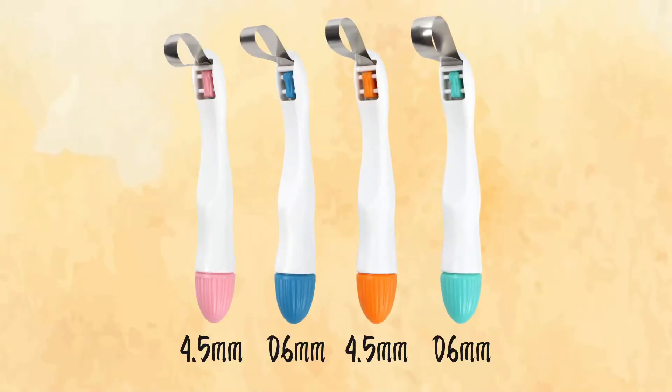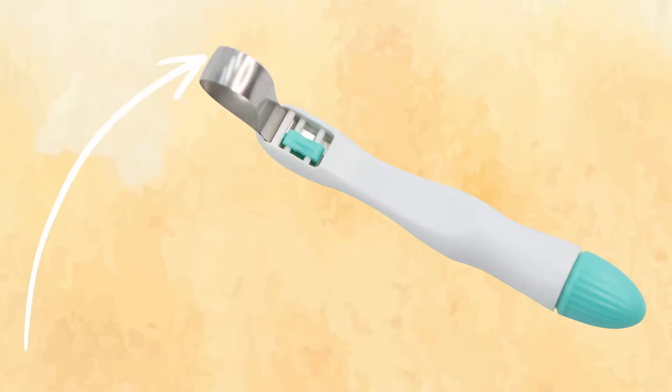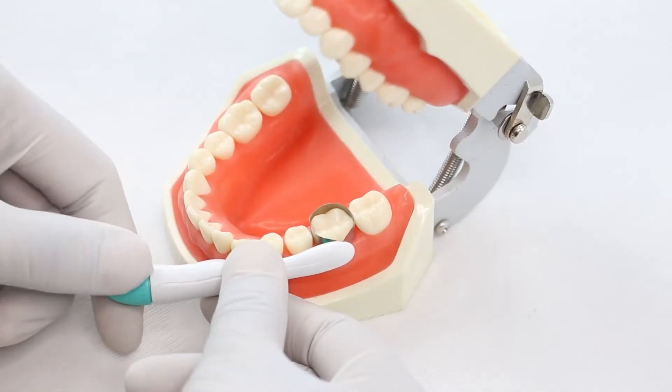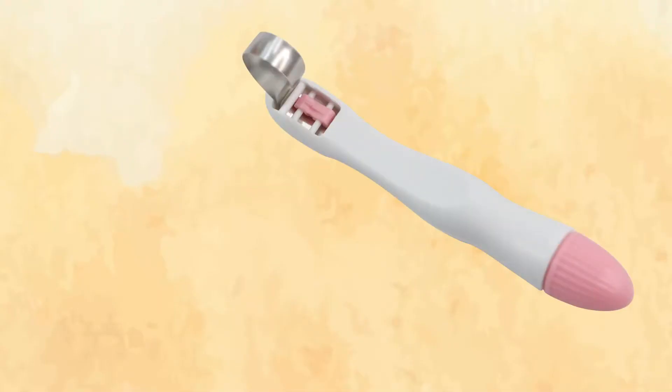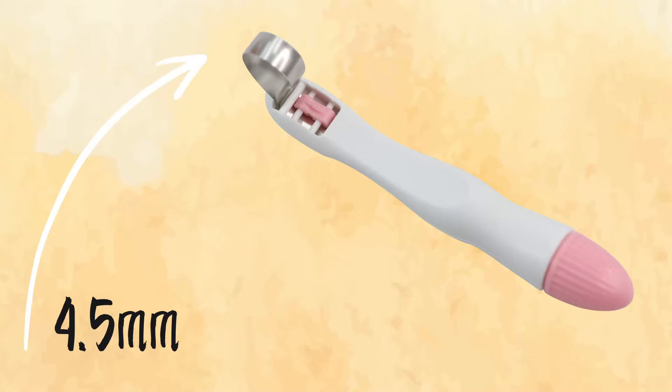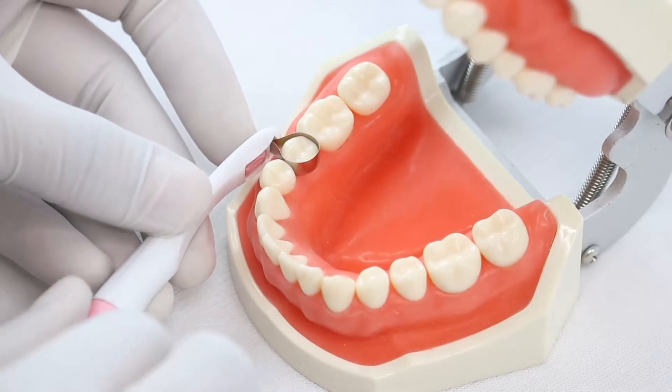It is available in four different shapes and sizes. The curved wide band with a bandwidth of 6 mm is available in green color, mainly used for molars. The curved narrow band with a bandwidth of 4.5 mm is available in pink color, mainly used for premolars and children.